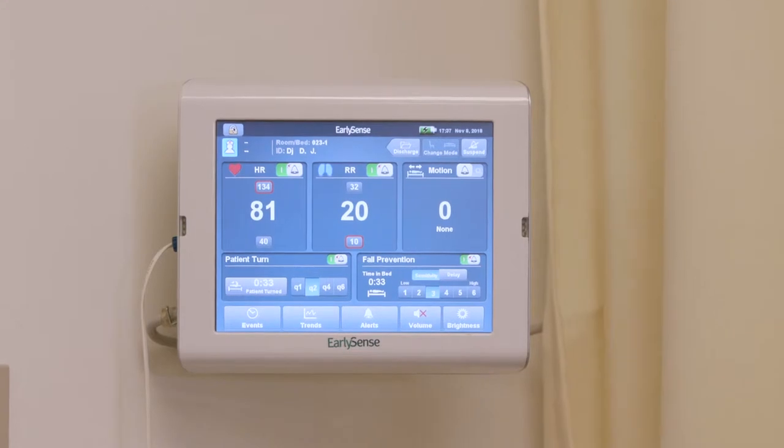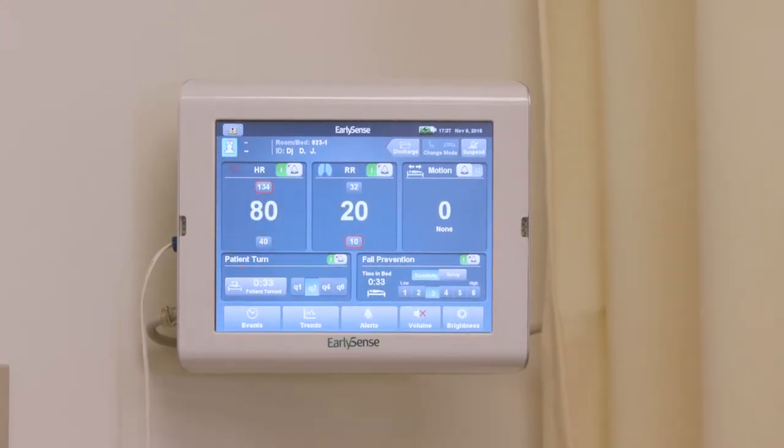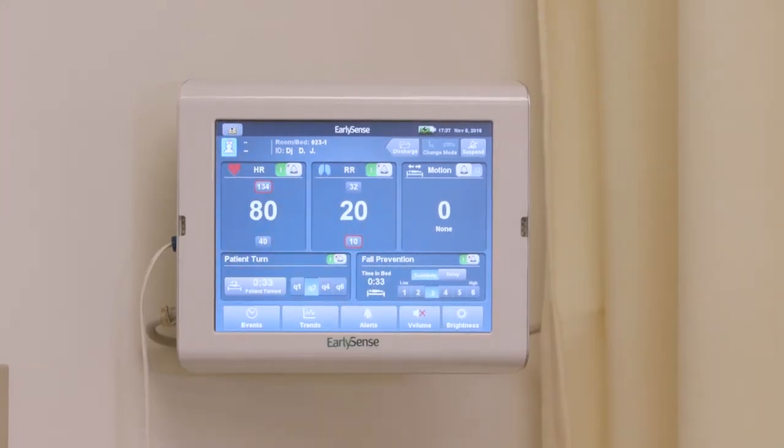Reminder: you will need to unlock the touchscreen by hitting the lock in the top left-hand corner.